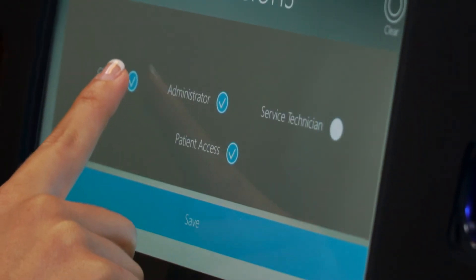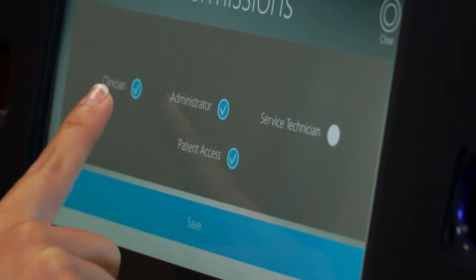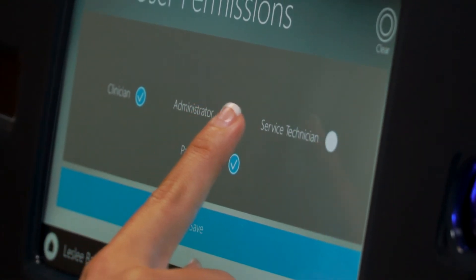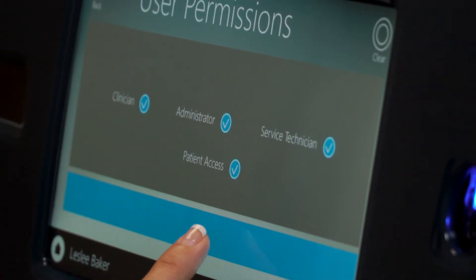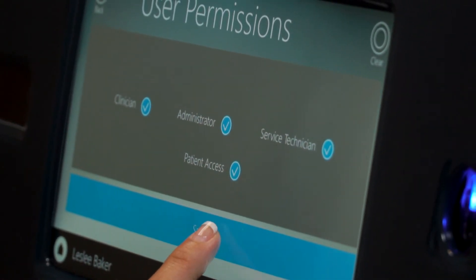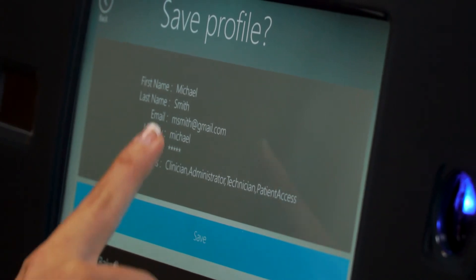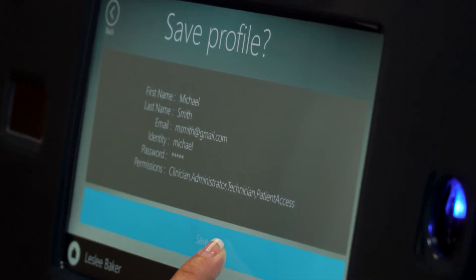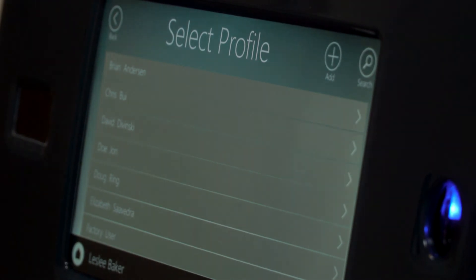Use the user permission screen to choose the type and access given to the new user account. Finally, review the new user information on the save profile screen and press Save to store the new user.